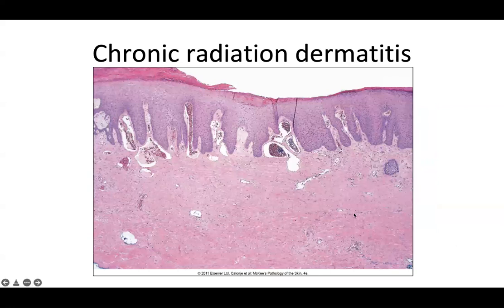Here's an example of a more chronic radiation dermatitis. You can see that you've got some reactive epidermal acanthosis in the area, some intermittent hyperorthokeratosis and parakeratosis. If there's been some breakdown of epidermis in different planes of section, you might get some leakage of extravasated red blood cells and serum components within that stratum corneum. Some dilated or telangiectatic blood vessels in the superficial dermis, as well as this kind of diffuse, parallel-running collagen, maybe some fibrosis as well. And then eventually you can even see some sclerosis, or what looks to even mimic the homogenization that you see in lichen sclerosis et atrophicus.